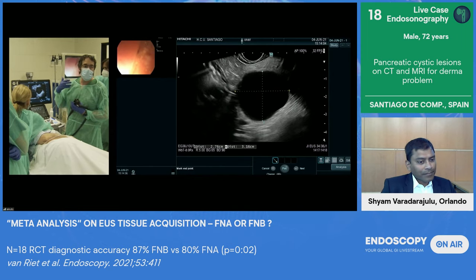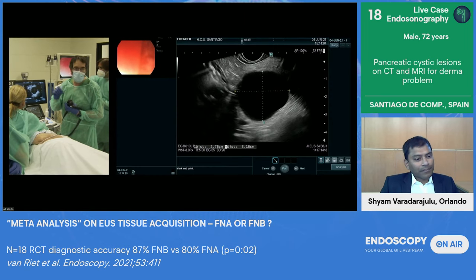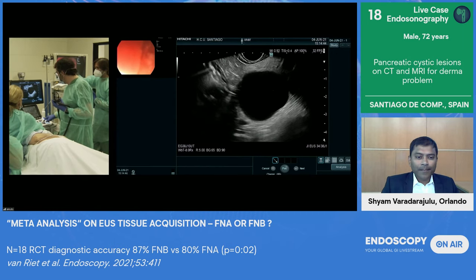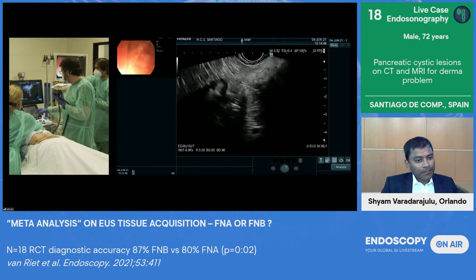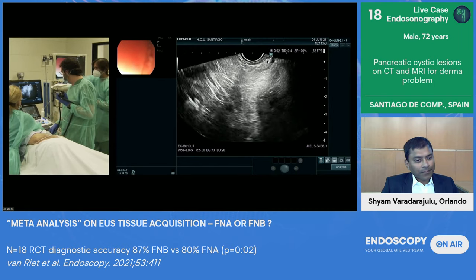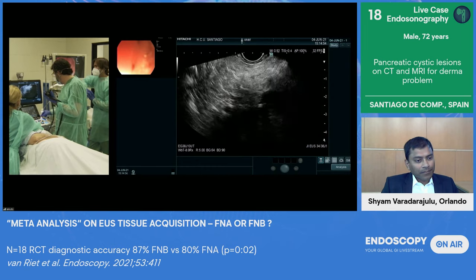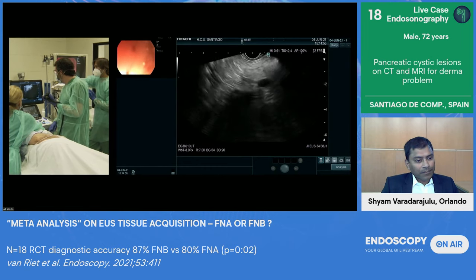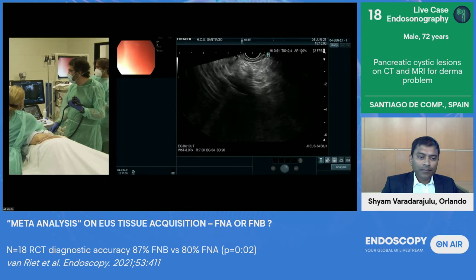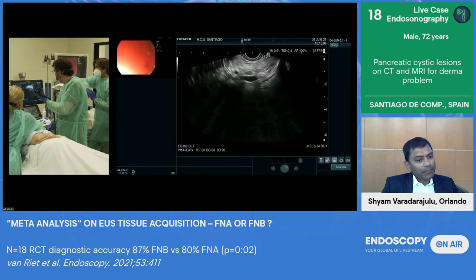So you increase your capability to detect small lesions or small artifacts or whatever you want to see when you're evaluating any kind of lesion. So if we go to the standard image that we usually see, we have already set it up. This is more common, and we go deeper, and we increase a little bit. This is how we usually see, but I really prefer to go to a more zoomed image because for me, it makes my appreciation and my evaluation better.